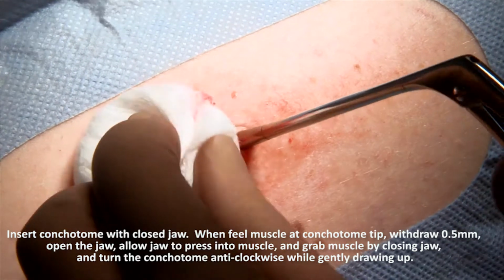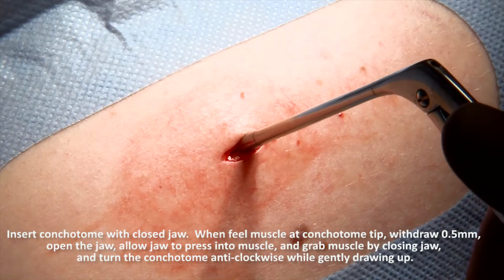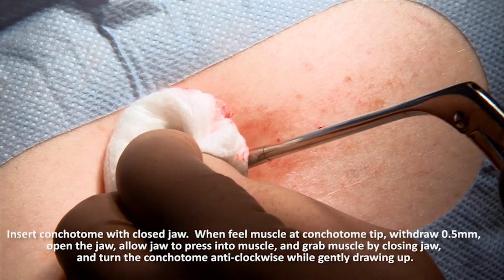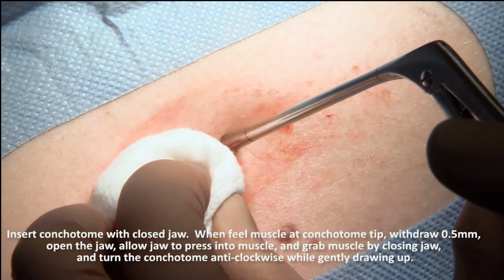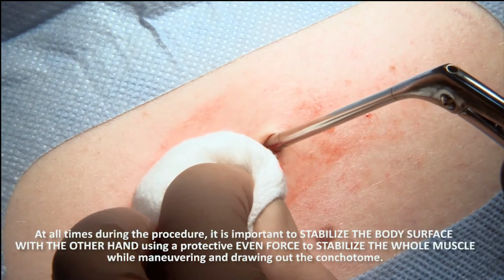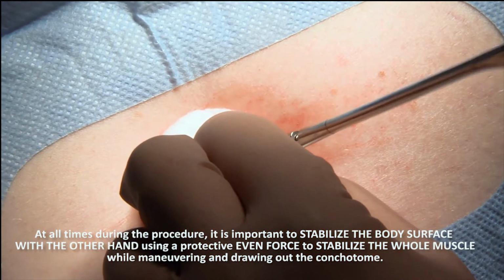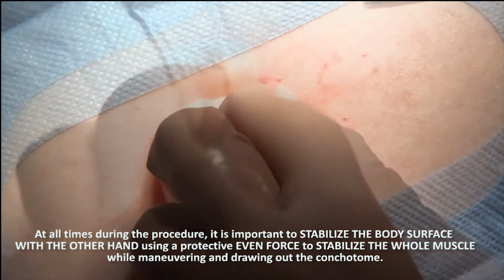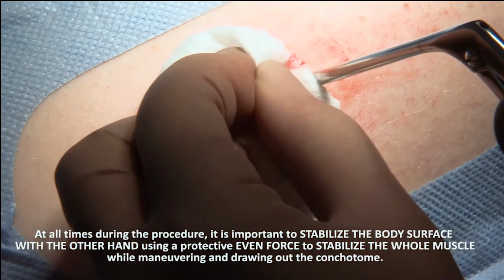When you feel muscle at the conchotome tip, withdraw 0.5 millimeter and open the jaw. Allow the jaw to press into muscle and grab muscle by closing the jaw and turn the conchotome anti-clockwise while gently drawing up. At all times during the procedure, it is important to stabilize the surface with the other hand using protective, even force to stabilize the whole muscle while maneuvering and drawing out the conchotome.